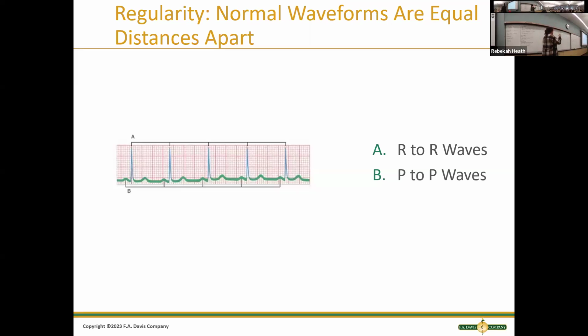And you would go up to your EKG and you would use your calipers and you would go, okay, from here to here, and then you would march it out. Bloop, bloop, bloop. That's really, nobody carries calipers. First of all, they get lost, and then you lose the cap and they're really sharp and you stab yourself in the leg. So I'm going to tell you guys how you can also measure distance without using calipers.